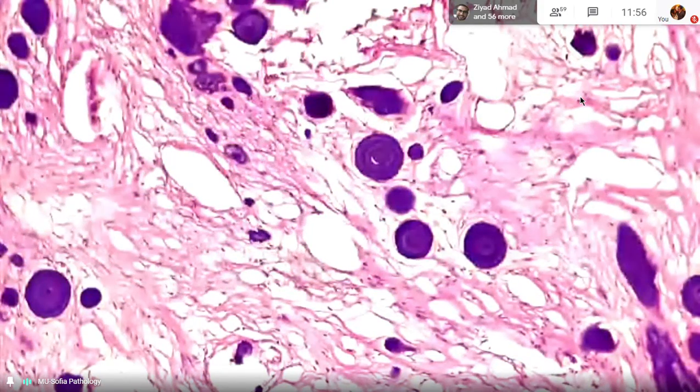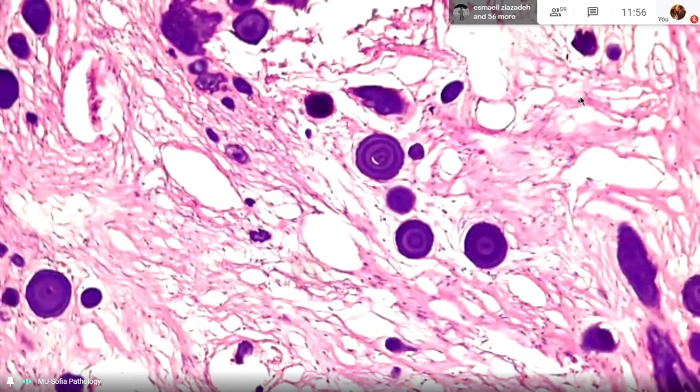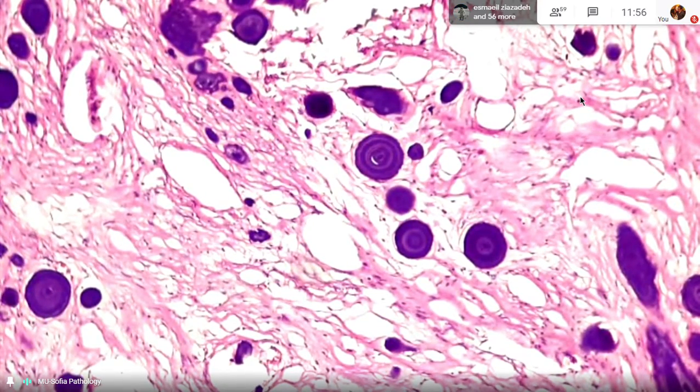Do you have a clear idea already of this meningioma and of the concept of the tumors of the nervous system? If you have some questions or if you have problems with differentiating. For the astrocytoma, you have the fibrillary background with the astrocytes, no polymorphism, no necrosis.